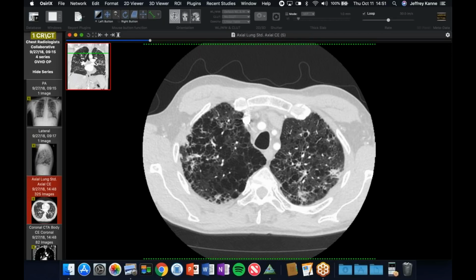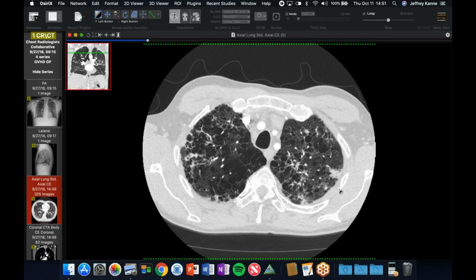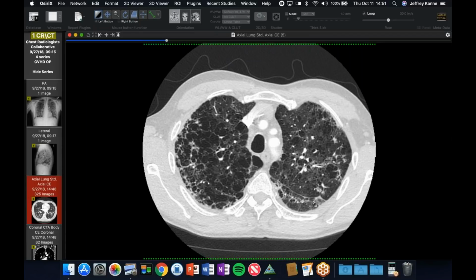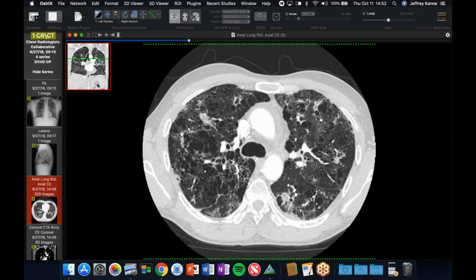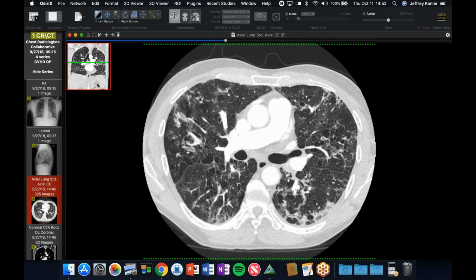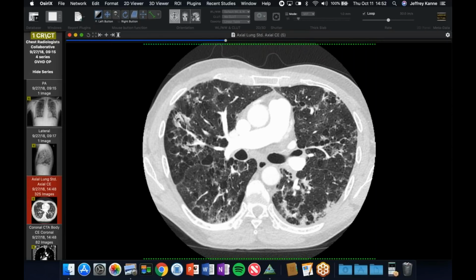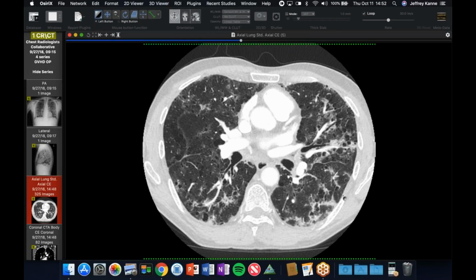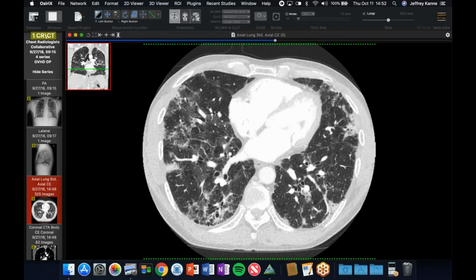And he's got a background of emphysema, which can confound the radiographic findings, but we do see these nodules. But also, if you look at some of the areas, you've got these perilobular bands of a mix of consolidation and ground glass. So if you subtract the emphysema, you've got a good look for an organizing pneumonia pattern, peribronchial right here. And then on the left, you've got the arcading along there, and nicer arcades down low. So a nice organizing pneumonia pattern of injury.